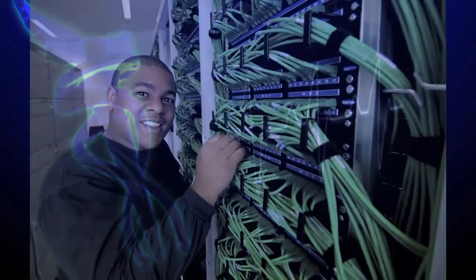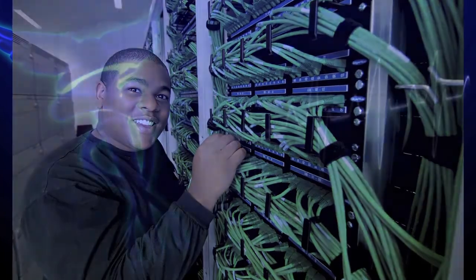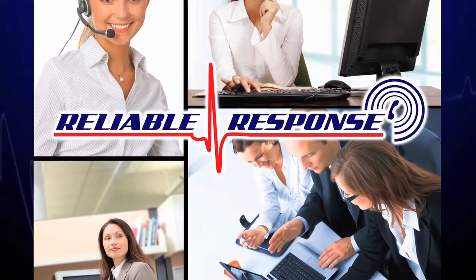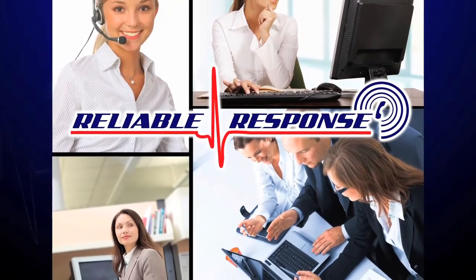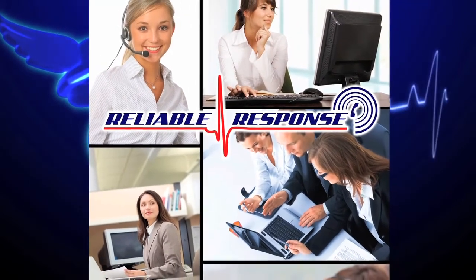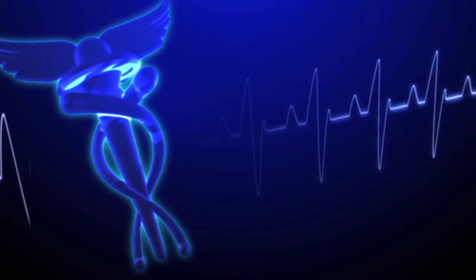Feel confident that our Eocene Systems team will be there to assist in every step of this simple implementation process. Our trained, reliable response team will set up and help manage your patient's Eocene accounts. They'll walk them through the product setup and the transmission process, and then provide them with 24/7 bilingual customer support.